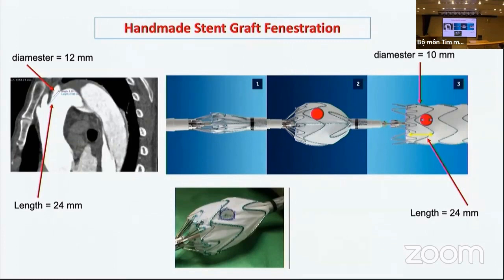Professor Hung, how much diameter of the hole do you puncture? Yeah, 10 mm. What is the diameter of the hole when you puncture? The diameter is 10 based on the diameter of the subclavian artery, right? Yes, based on the CT guide.